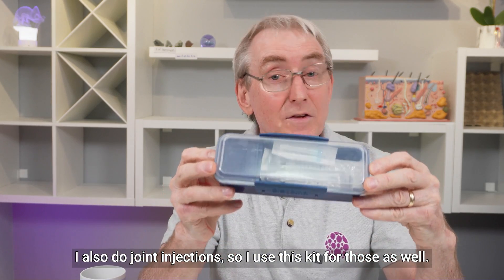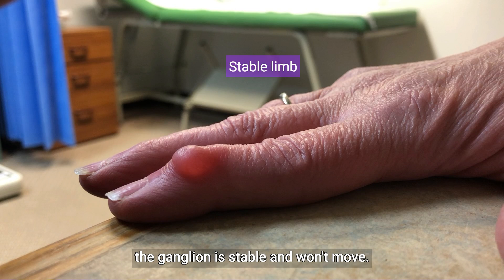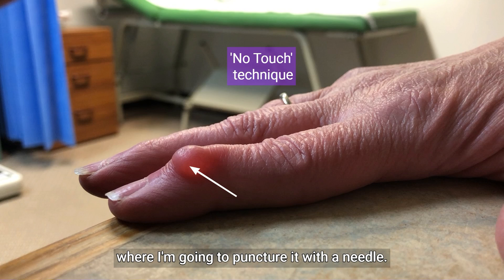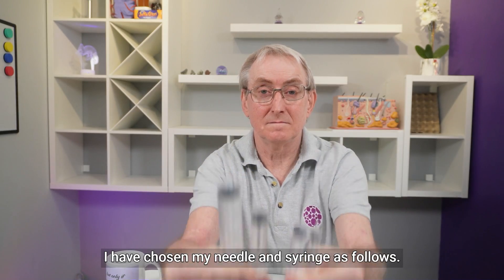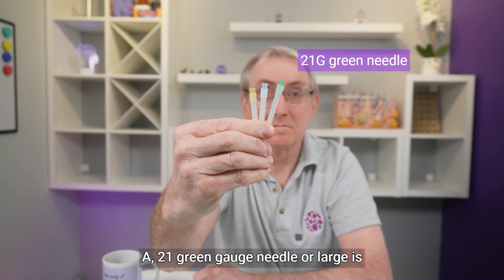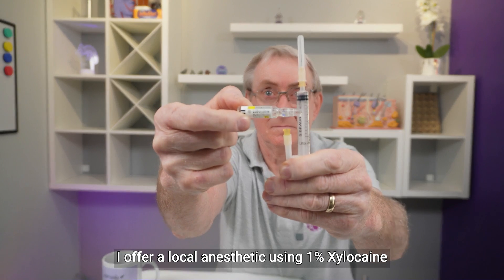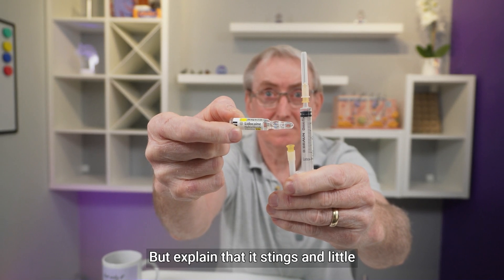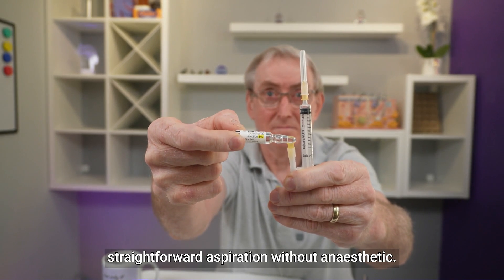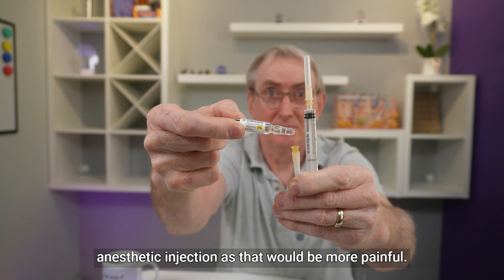I arrange the patient so the limb with the ganglion is stable and won't move. I use a no-touch technique: I clean the ganglion with an alcohol swab, especially where I'm going to puncture it. I have my gloves on. A 10 ml syringe is needed — any smaller and the suction usually isn't enough to draw out the gel-like contents. A 21 gauge green needle or larger is needed — smaller and it won't work. I offer local anaesthetic using 1% xylocaine and a small 25 gauge needle, but explain it stings with little benefit over a straightforward puncture. Nine out of ten patients opt for aspiration without anaesthetic.